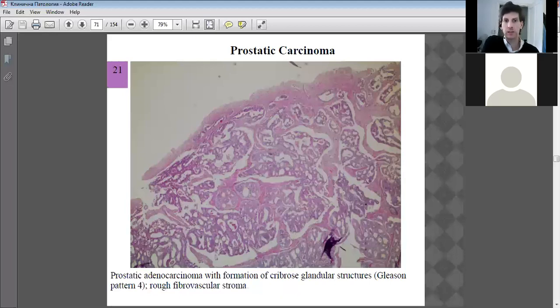The prostate gland tends to be a gland that's surrounded by a capsule, which you can see here. The cancer then develops in little pockets inside the gland, roundish pockets, sort of localized areas in the gland. And this is why it takes a bit of a while to spread as such. Because most men, by the time they reach 85 years old, have some of these round pockets as a consequence of aging, but they never turn carcinogenic. Something has to trigger that.